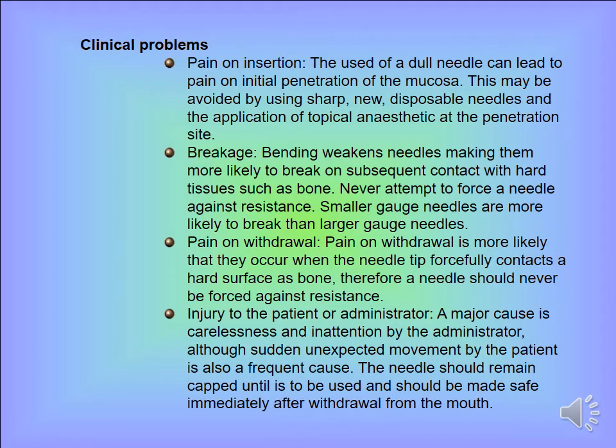The breakage. Bending weakens needles, making them more likely to break on subsequent contact with hard tissue such as bone. Never attempt to force a needle against resistance. Smaller gauge needles are more likely to break than larger gauge needles.